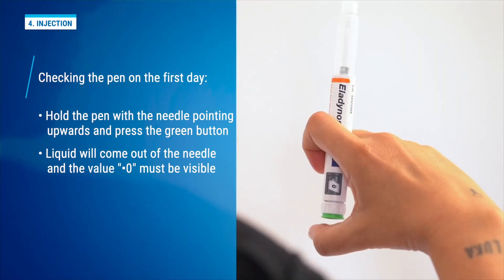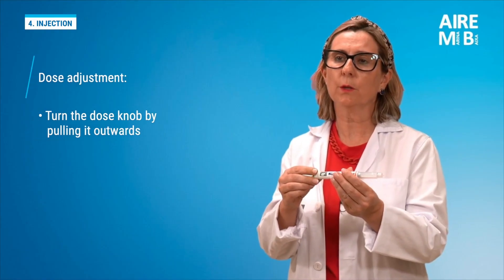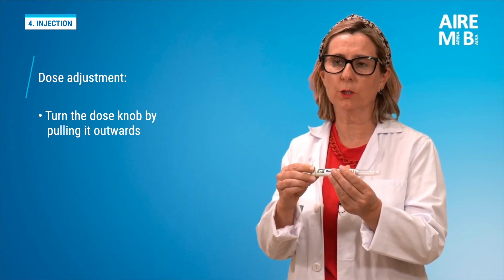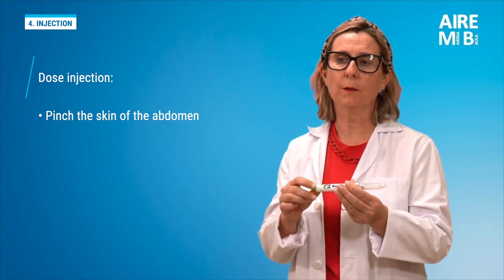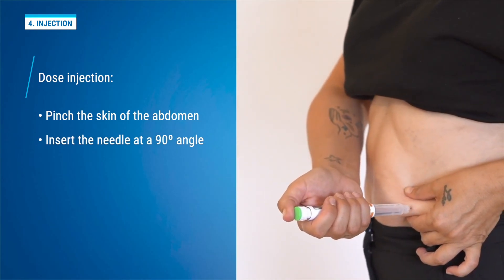There should be zero visible in the dose indicator window. We gently rotate the dose dial of the pen away from us in the clockwise direction until it stops. The number 80 will be displayed in the dose indicator window. We gently pinch the skin of the abdomen and slowly and steadily insert the needle at a 90-degree angle.